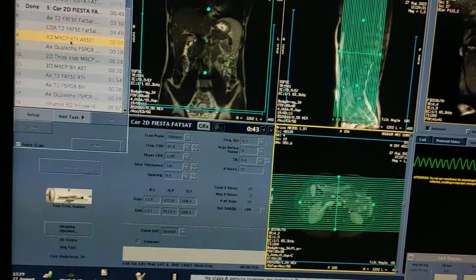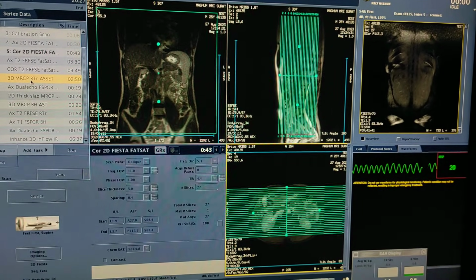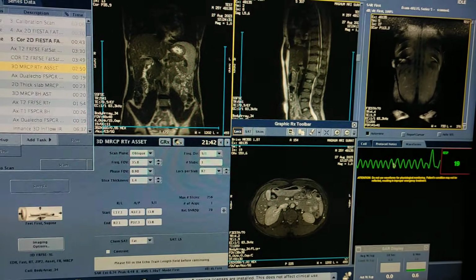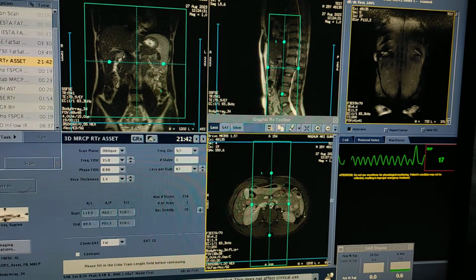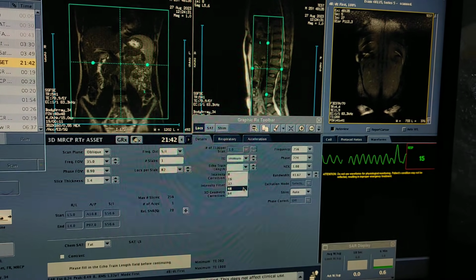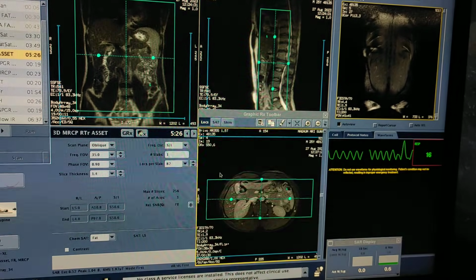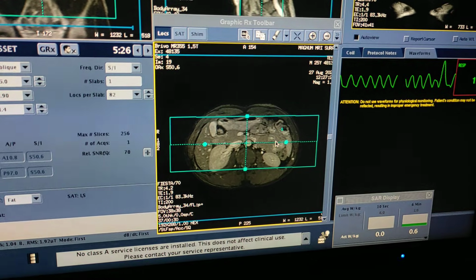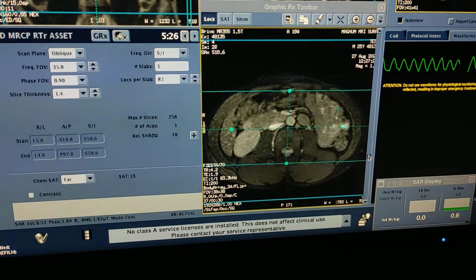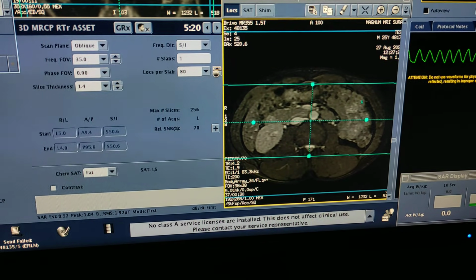Now, first of all, I will plan the 3D sequence for CBD, pancreatic duct, gallbladder, cystic duct. Okay, so you have to click on this 3D respiratory asset. You have to plan 3D on axials. Enter over here. So now you have to localize on axial. You have to zoom. You have to simply cover gallbladder and pancreatic area. There is no need to cover this vertebra. So you can reduce the slices.